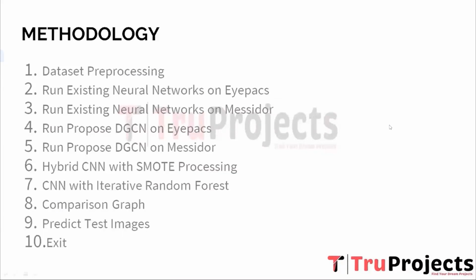So now coming to the methodology part. First, data pre-processing. This step involves preparing the raw data for training and testing. It includes tasks like data cleaning, normalization, resizing images, handling missing values and splitting the data into training and testing sets.